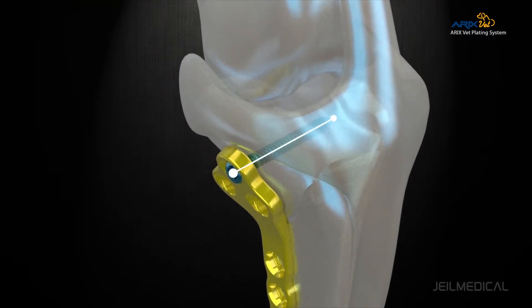Each hole of the plate is applied with a variable locking mechanism, where screws can be inserted up to plus or minus 15 degrees around the screw axis when necessary.